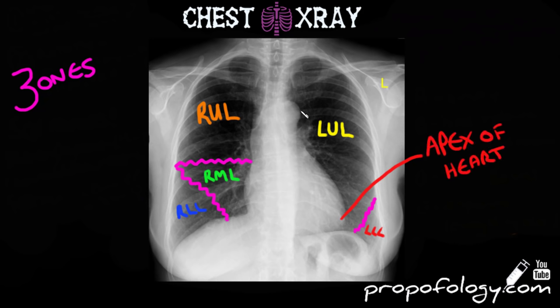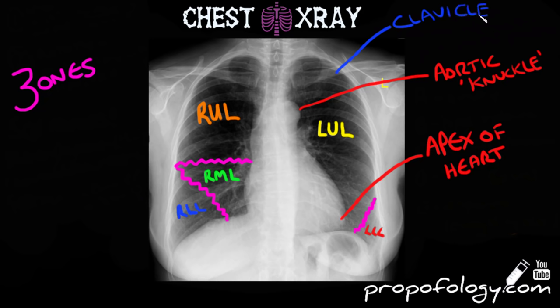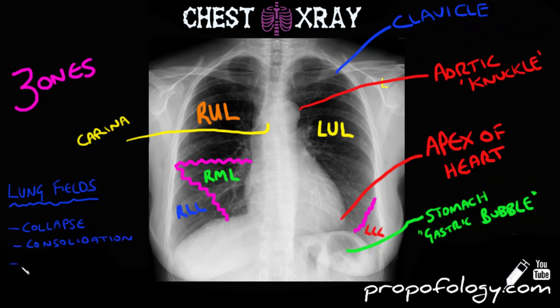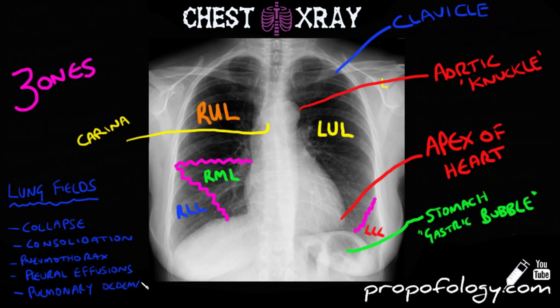You can see the apex of the heart, the aortic knuckle which is the arch of the aorta as it comes off the heart, the clavicles at the top, and the carina — the bifurcation of the trachea into the right and left main bronchus. Something that sometimes catches people out is the gastric bubble, which is air in the stomach sitting under the left diaphragm. When looking at the lung fields you should consider whether there is consolidation, collapse, or pneumothorax — that is, air in the pleural cavity where lung markings don't reach the edge. Also consider tension pneumothorax with tracheal deviation, pleural effusion which is a fluid collection compressing the lungs, or pulmonary edema within the interstitium of the lung itself.